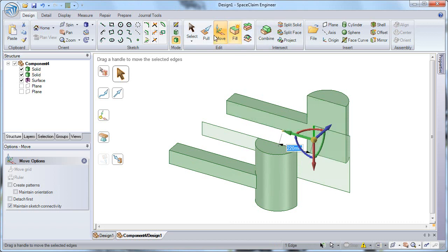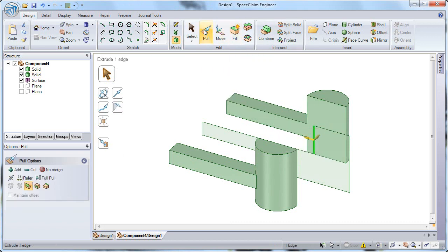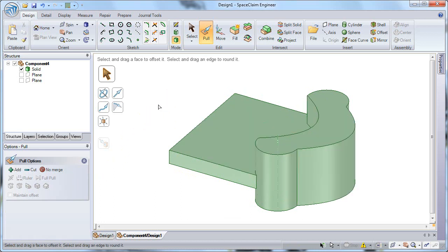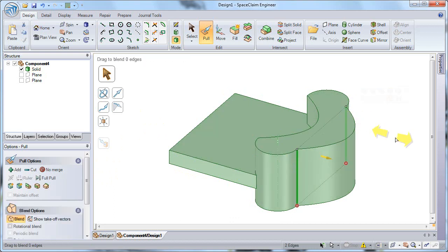So I'll go back to my Pull tool, select on my three faces that I've created, Control selecting to select all three, and SpaceClaim will know that I want to blend by default, so when I hit Enter, it's going to automatically blend between those three faces. So now I can round off these corners, Control selecting both of those vertical edges. It wants to blend by default, but I can go and toggle that option off from my options menu, and then I'll be able to round those two edges.